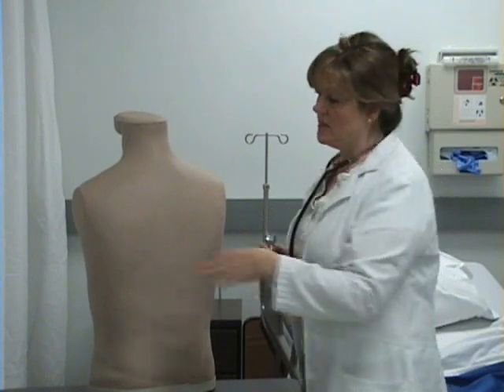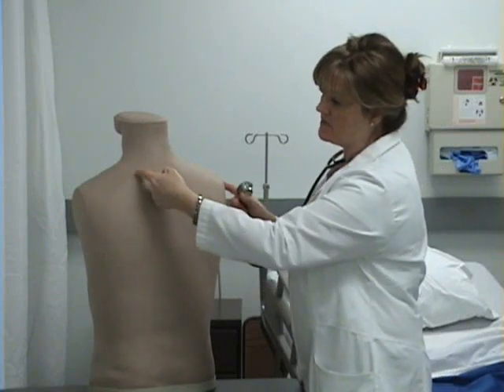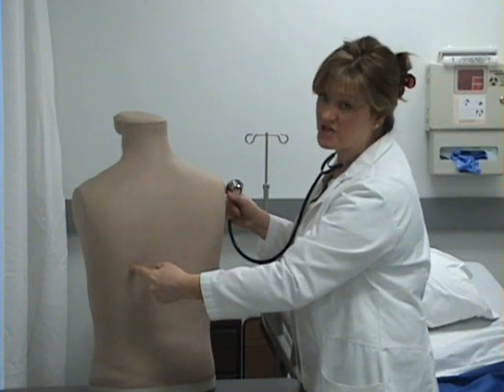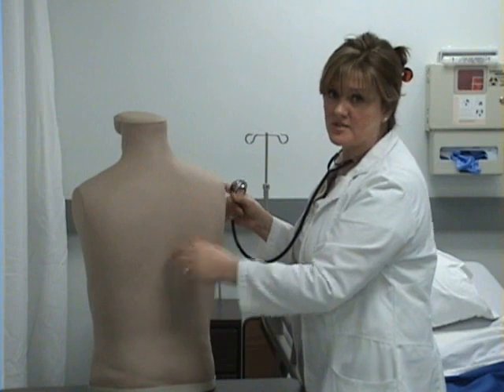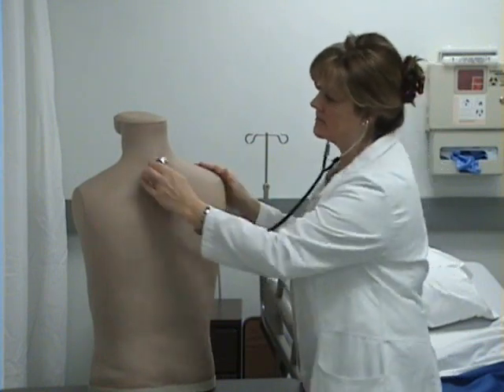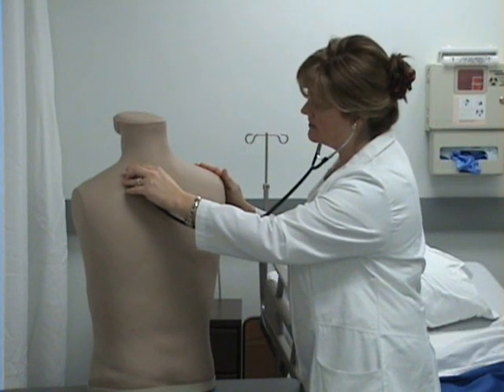Now, posteriorly, you're going to listen a little bit different. We've got the scapula here and here. Again, we don't listen over bone. So we have to be careful to start at the apex and move in a C fashion. So we're not listening over the scapula, and we're not listening over the spine. No bone. A deep breath in and out.